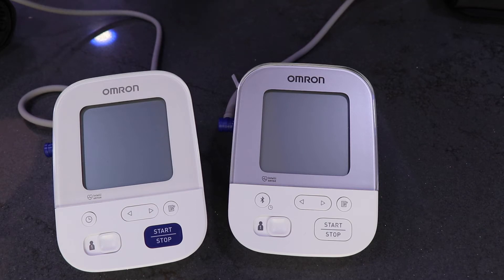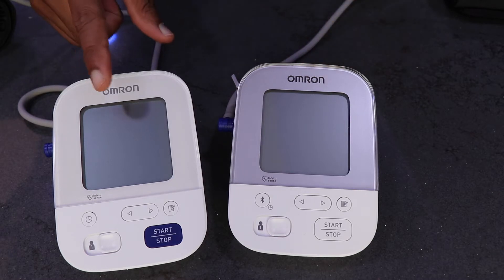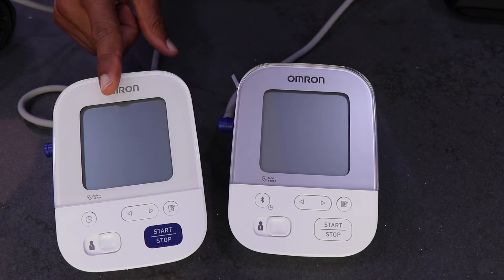Today we're going to test whether it really matters whether we wear the cuff on the left hand or the right hand when we're taking our blood pressure. I've got two Omron blood pressure monitors — one is the X4 and the other one is the X3.